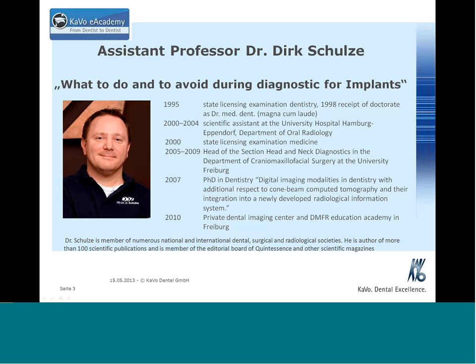From my point of view, if sclerosis is a normal reaction of the bone to inflammation, and the origin of the inflammation is gone, in case of typical sclerotic changes due to periapical changes, I don't see any obstacle for an implant insertion.